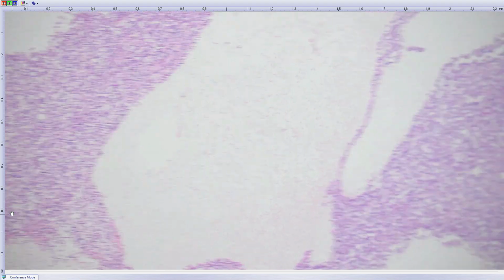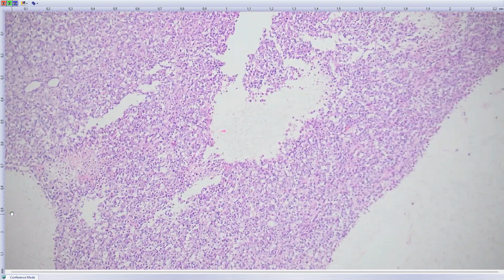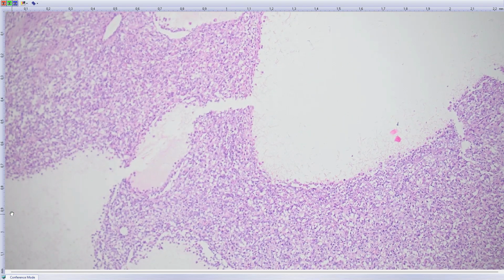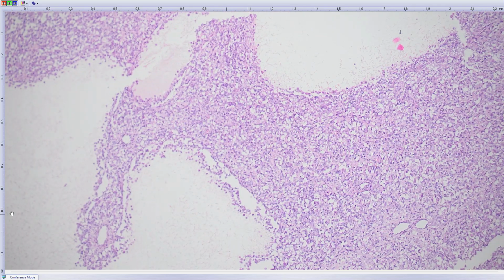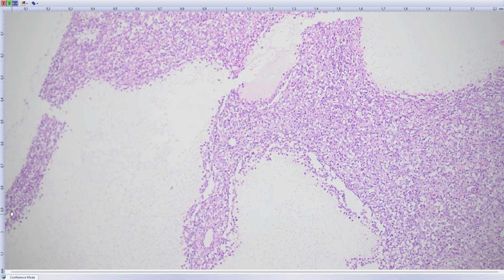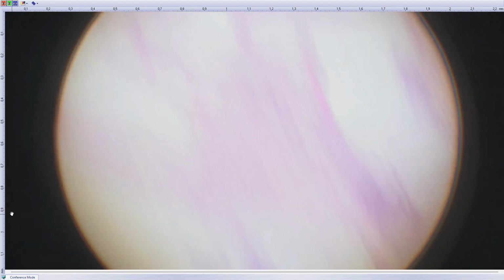The main differential diagnosis, I would say, if we leave out germ cell tumor, this is not germ cell tumor, is juvenile granulosa cell tumor or the small cell carcinoma of the ovary of hypercalcemic type. So we can resolve this easily by immunohistochemistry.